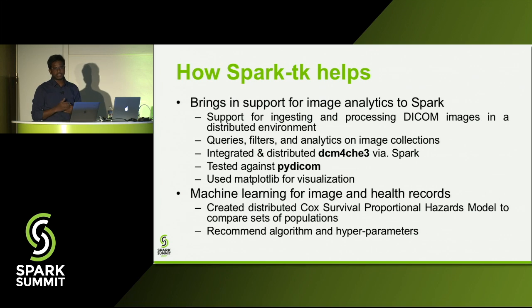So as Anahita mentioned in the previous slides, there are different open source tools for accessing and processing DICOM images, like dcm4che, which is healthcare enterprise level and widely used, but that is developed in Java, which is not distributed. And we have PyDICOM, which most Python data scientists know very well, but using PyDICOM, you can load only a single image at a time, which is not that efficient for distributed work.